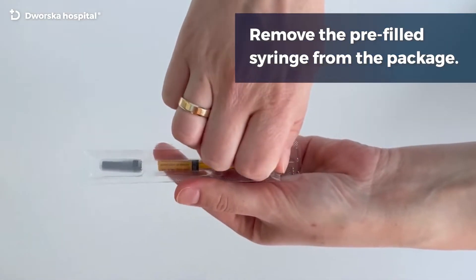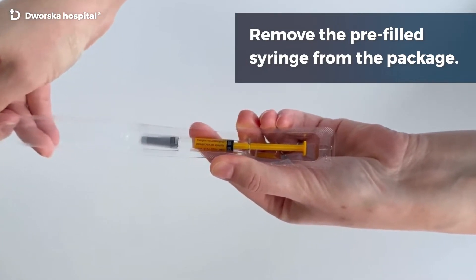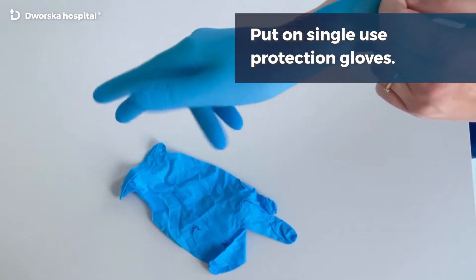Remove the pre-filled syringe from the package. Put on single-use protection gloves.